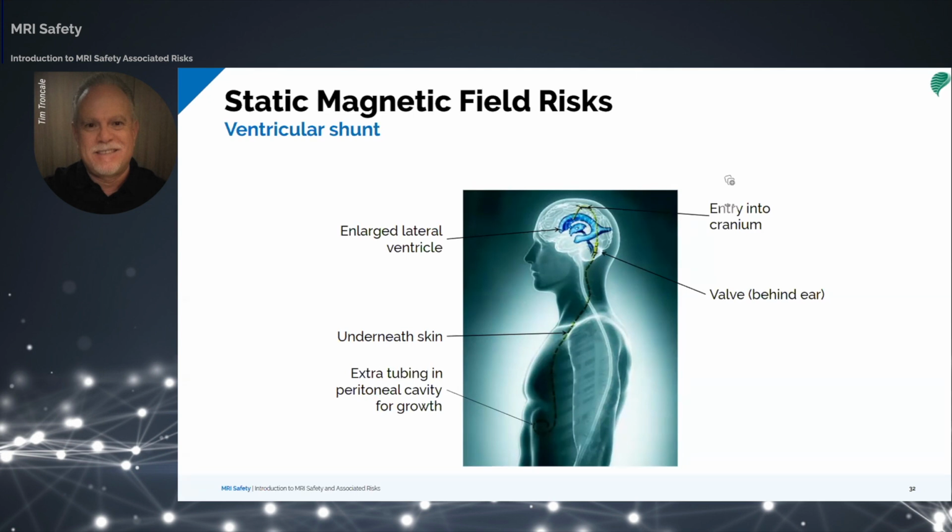Most of this system is MR safe. However, the other parts are MR conditional, so therefore the entire unit is listed as conditional.